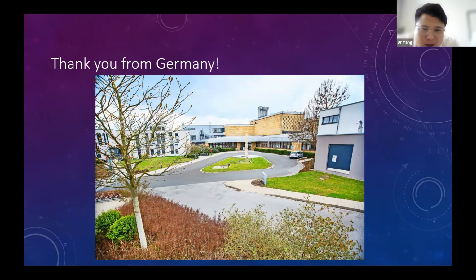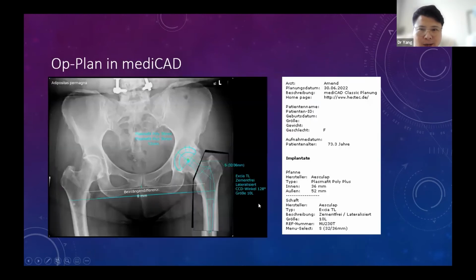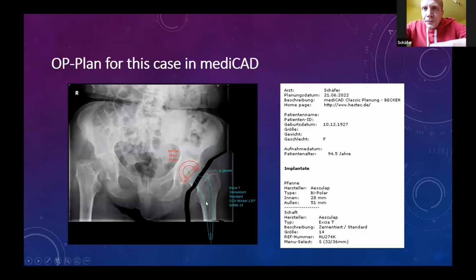We want to ask a question for Dr. Schäfer. So I saw your slide. You do the plan. You just do templating in the AP position of the X-ray. In the ML position, do you do that too?